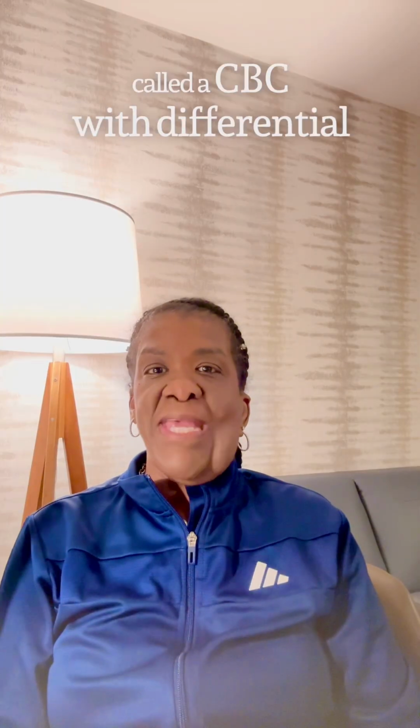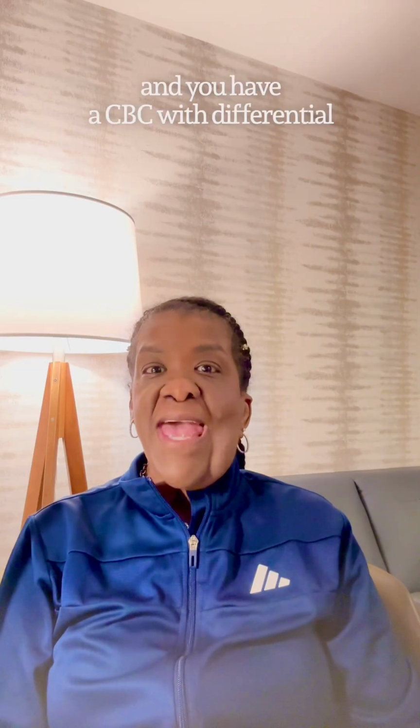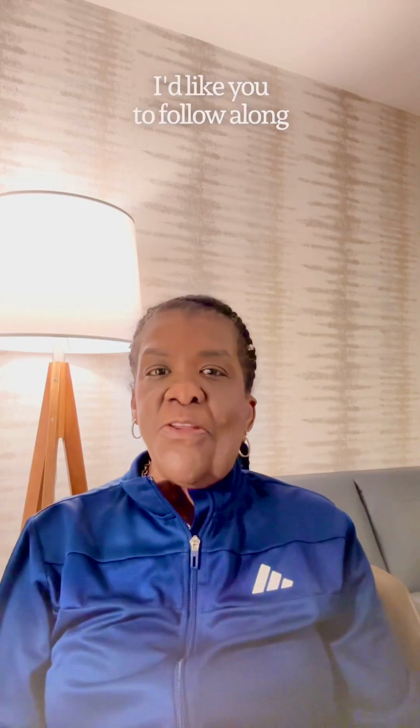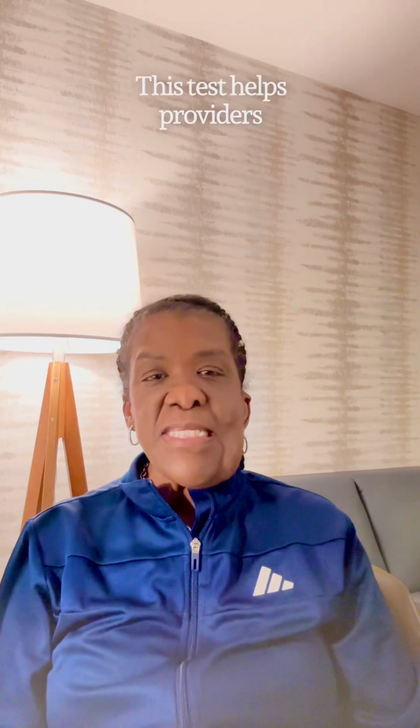Today, we're going to talk about a blood test called a CBC with differential. If you have your MyChart or patient portal available and you have a CBC with differential, then welcome along. I'd like you to follow along as I review the basic components of your CBC. CBC stands for complete blood count. This test helps providers understand what's going on inside of your blood.